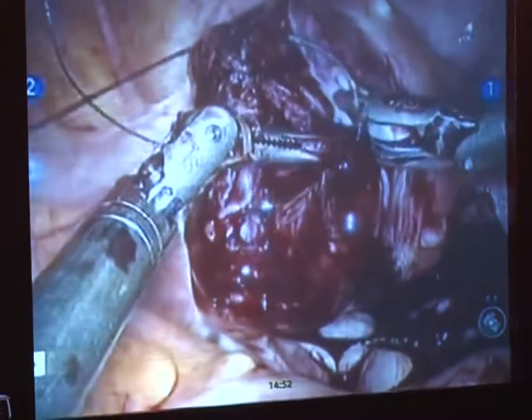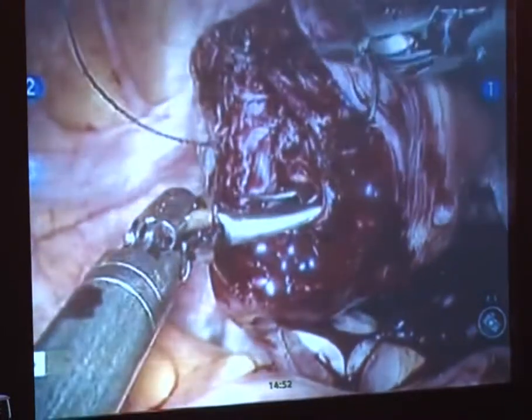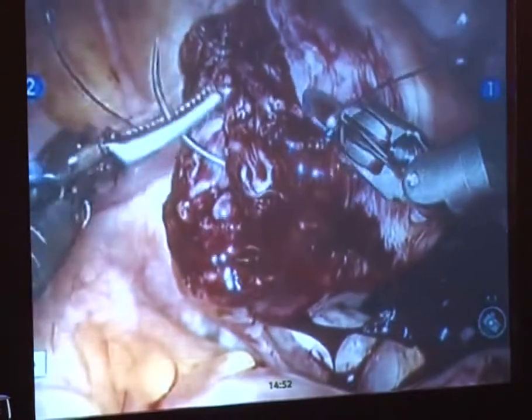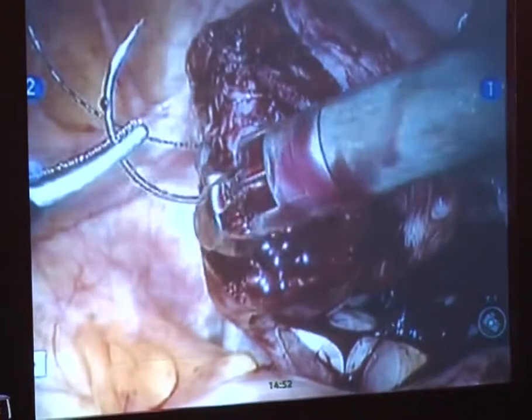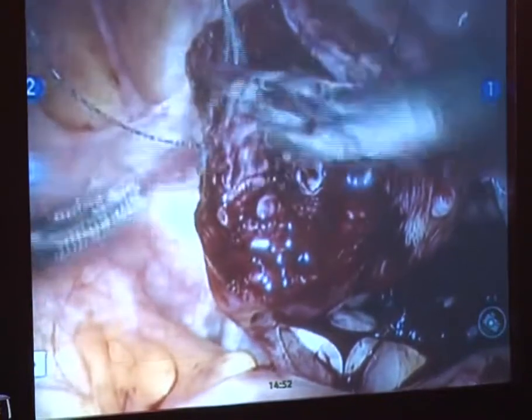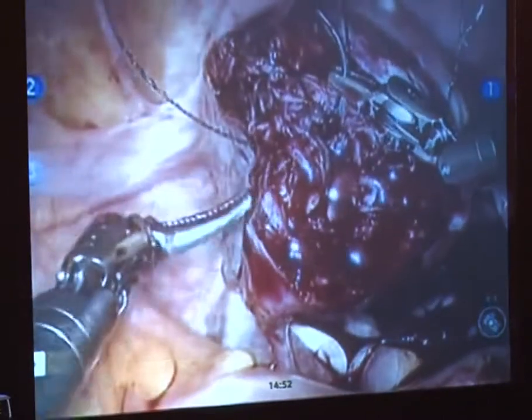This is where it gets a little tricky as you get down. That's what I mean by you gotta do some creative bites when you're closing with barbed suture, when you're sewing vertically, whether it's barbed suture or traditional suture. Because you're maxed out at the wrist in this orientation, so I do a lot of backhanding.